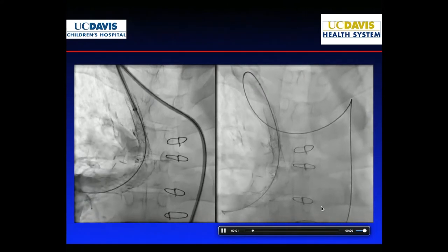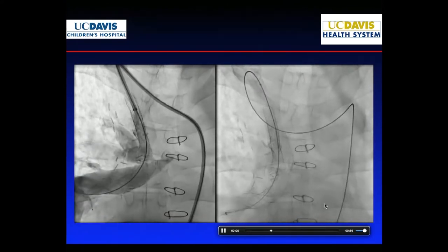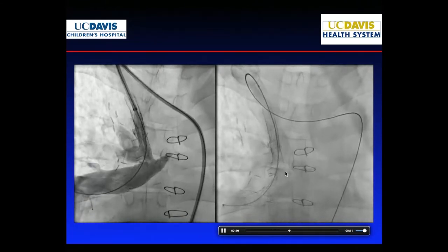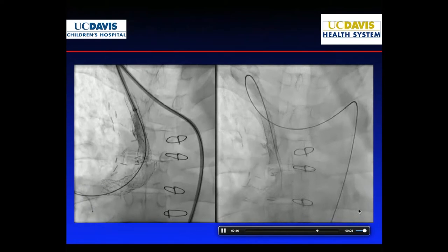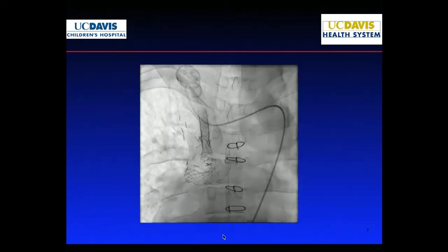away from that stenosis. Earlier, the stiff wire had actually kept it in position, but because of the manipulations, at this point, the stent is no longer on the stenosis. Again, the mistake there was probably going with a bigger balloon. Maybe we should have just said, leave it alone, let it endothelialize and come back. But that was pursuit of perfection and paying the price.